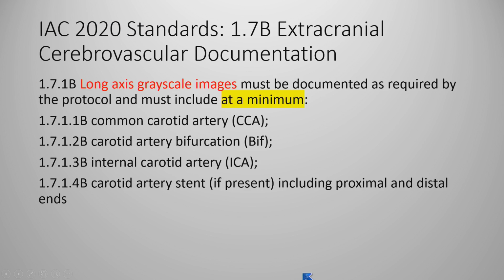So just to review what the IAC has established in their 2020 standards, to go over what is required. Many times I go into a facility and they'll say, well, the IAC doesn't require this. I want to emphasize, I took this directly from their literature, and I've highlighted what is at a minimum the minimal standard for what you need to show when you do a carotid duplex ultrasound study.